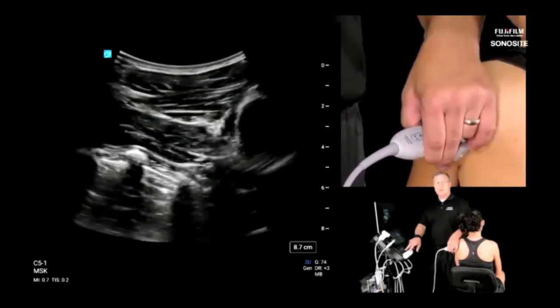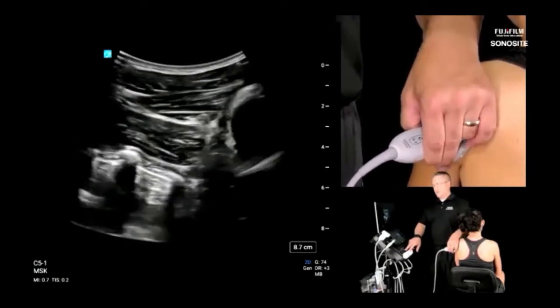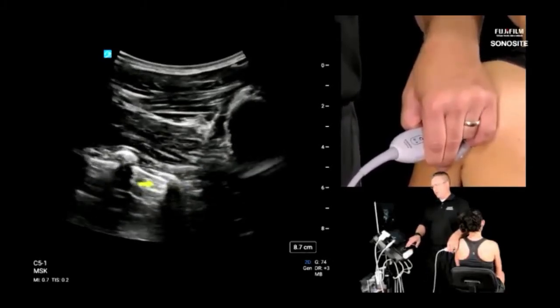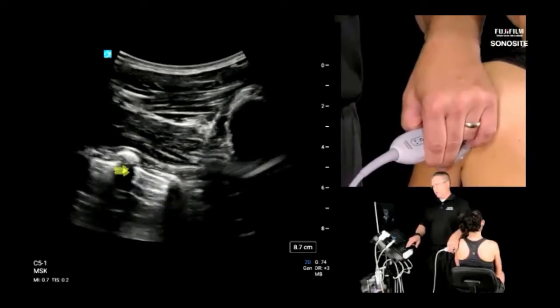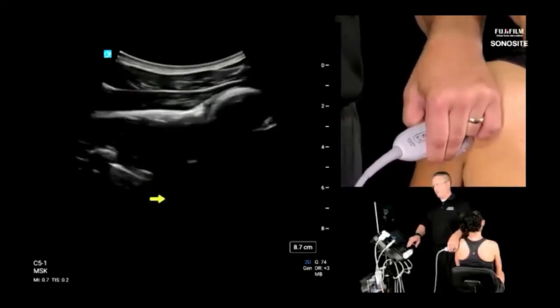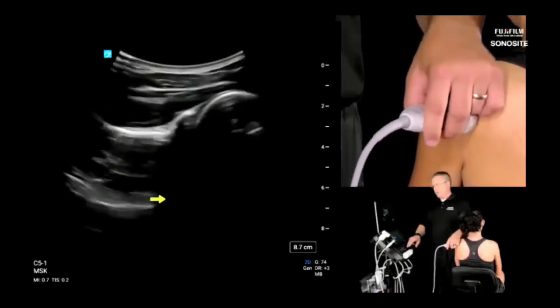Those are rib shadows. Wow. Way down at the bottom of the image. Yeah. Here, and then this is sliding along, pleura, another rib. That's impressive. Rib. Isn't that cool? Yeah, very cool. I think that just about every time we scan something new.